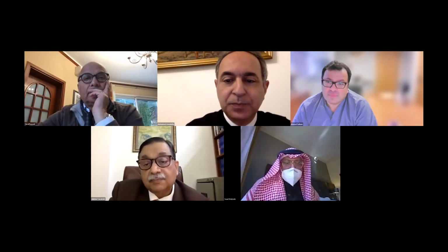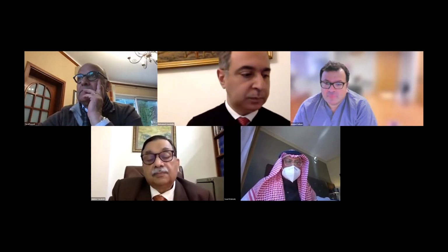Dr. Abdullah, can I just add one last comment here? Sure. I think the main point here is to do a good surgery. You want to make sure you remove all the vitreous, all the membranes. And if you do that, more than likely, you may not even need to use silicone. I am not talking about Dr. Fayyad's case, because he had a very tough case. But I think it's important for people to understand that silicone does not protect you if you don't do a good surgery. Right. This is the exact message we need to convey to the audience.